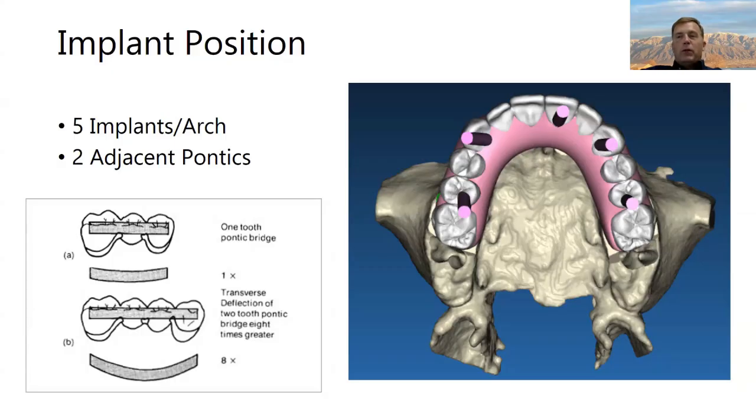So, especially when you think about that our patients could be applying 4 times normal occlusal force in these cases, there are no materials. We'd have to make it out of unobtainium, which is an engineering joke, something that doesn't exist basically, to do 64X. 27X is pushing the limits. So one other thing that you see with 5 implants is now all of a sudden we don't have long pontic sections. So we're again putting our restoration in a more favorable position to avoid breakage.